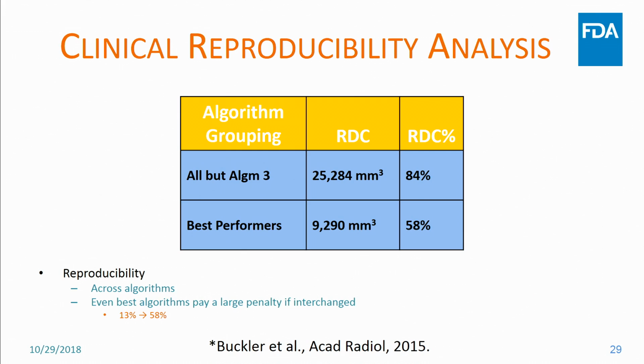So this tells us something about how we need to control our algorithms, our imaging in a trial in order to achieve whatever performance we need. If we need to get down to 13 or 14% of performance, we need to be using the same algorithm at every iteration of the analysis. If we could live with the 50 or 60% variability associated with the algorithm, maybe all we have to do is control the imaging and we can be okay. So this is where this idea of what the effect size is relative to what our variabilities are important. What we need to do is be able to measure them, understand what we can control, because in clinical practice, it's going to be hard to control the scanner everywhere. It's just not very realistic. So what can we control? And then what are the variabilities we can live with? And then what effect sizes are enough that we can see differences?